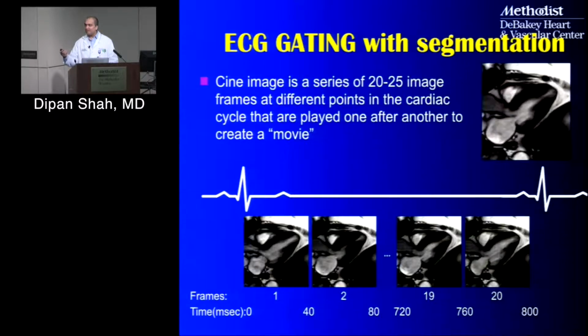So for standard acquisition, it's probably about 30 frames a second. And then with CMR, we're typically dealing with about 20 to 25. But again, just as with echo, you can adjust this however you want. But again, everything comes at a trade-off. So if I want more frames per cardiac cycle, then it's going to acquire a longer acquisition time, therefore a longer breath hold.